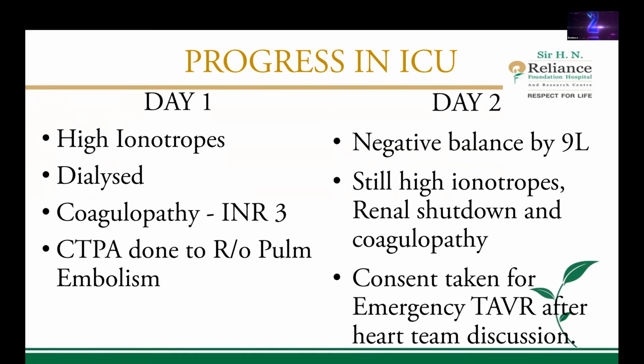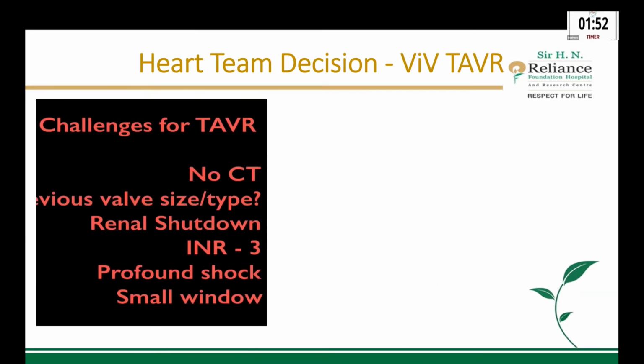Day 2, the patient is still in negative balance, but still requires very high inotropic support, with complete renal shutdown and worsening coagulopathy. At this point, we offer TAVR to the family. They agree. Now, what are the challenges for this TAVR?